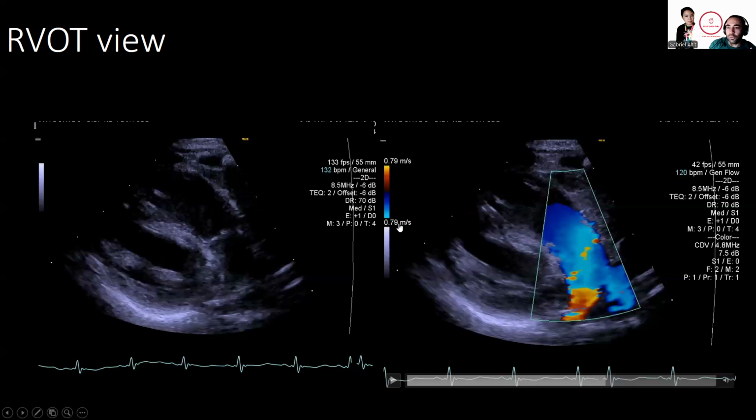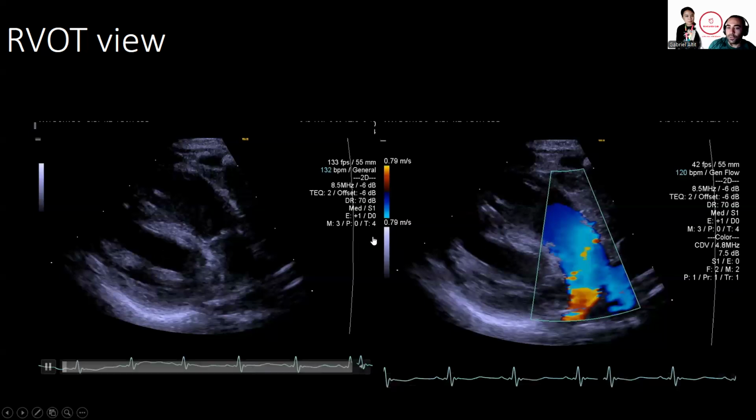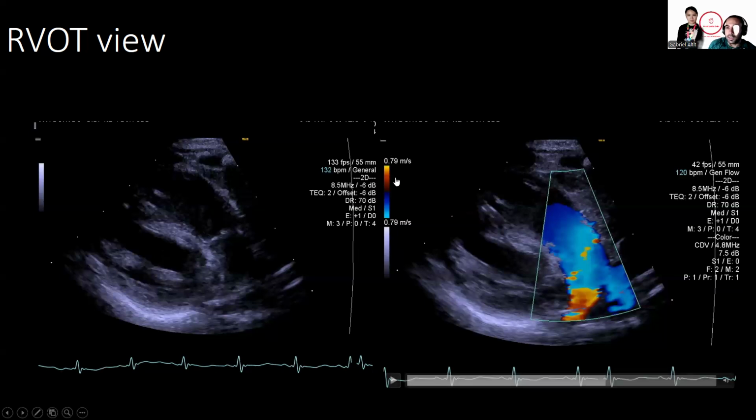So typically, if you have arterial flows, high velocity flows, aorta, blood flow going through a stenosis, blood flow going through atrioventricular insufficiency, we'll typically use a higher velocity filter, or sometimes we call it the Nyquist, in order to truly see this high velocity flow, without the machine being confused about the directionality of where the flow is going.